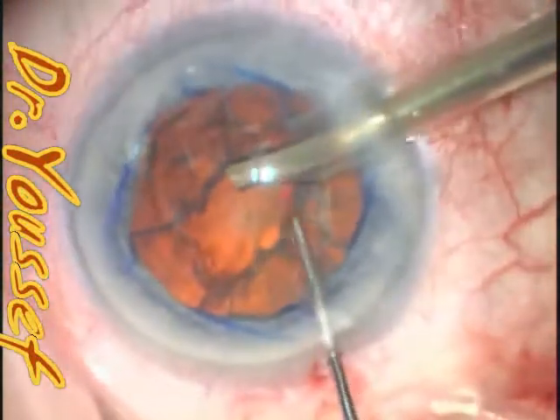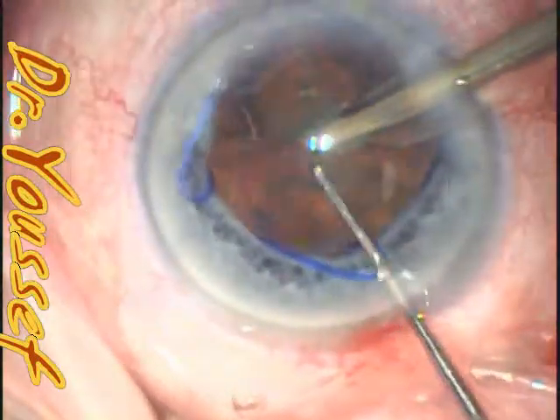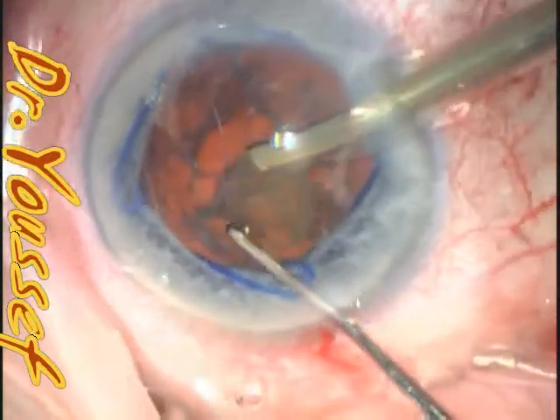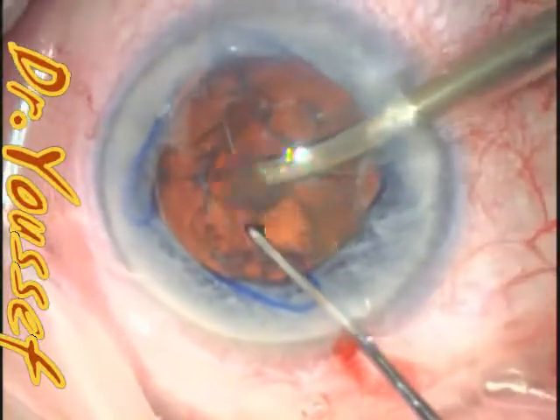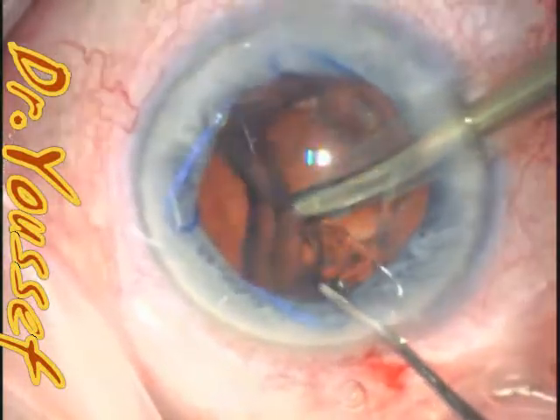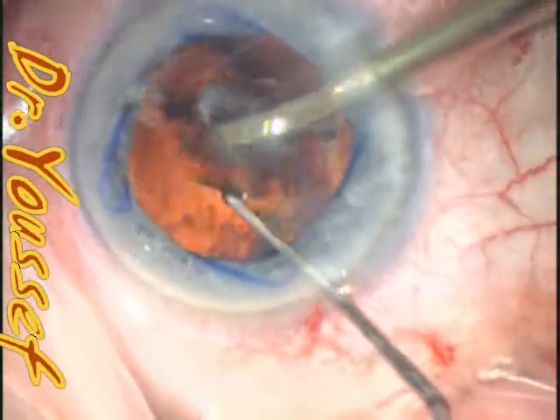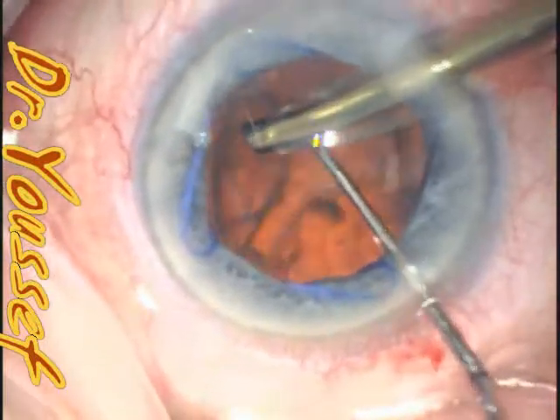In this video I wanted to show the importance of visualizing the tip of the J-Cannula, because the J-Cannula is very, very safe to use for irrigation aspiration or for cortical cleanup, but it can be complicated if the visualization is impaired or the location of the cannula is not checked. So while I'm doing the phaco here, I'll start talking about that.